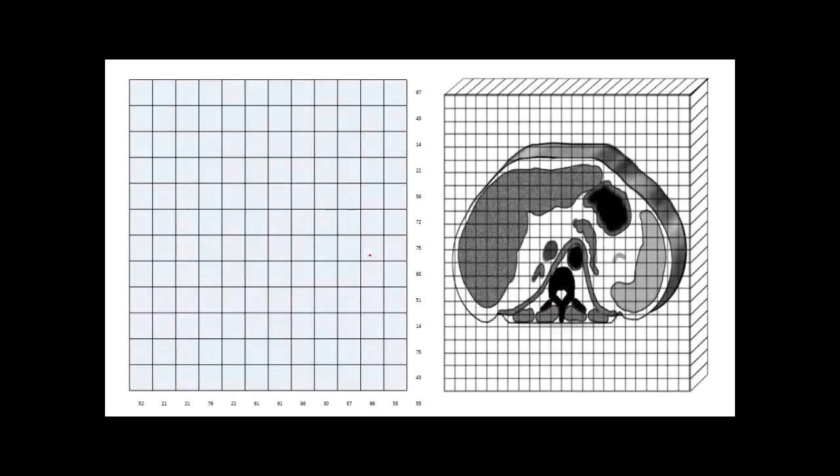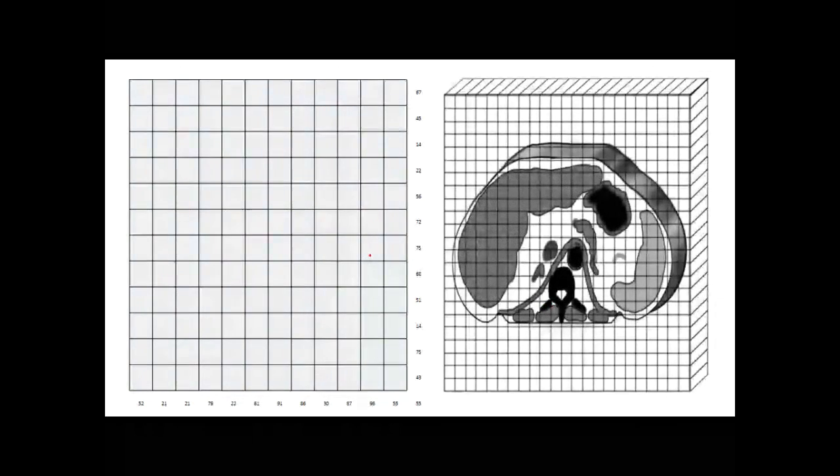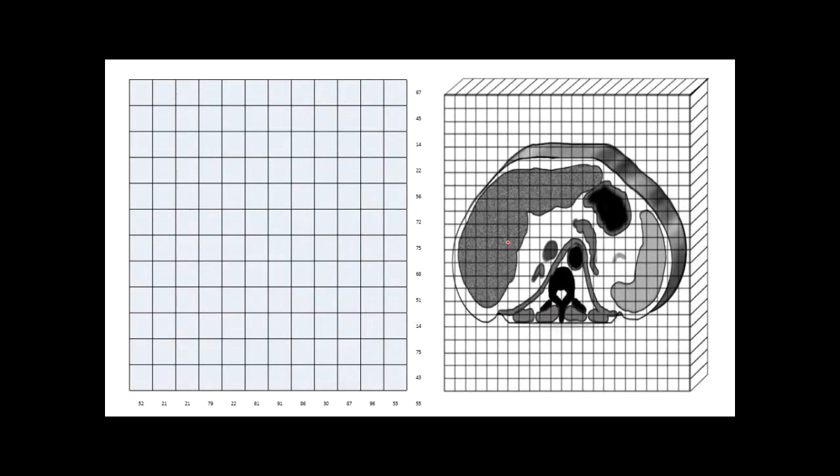Now, just multiply it by 1,000 pixels, for example, and you get the same image, following the very basic principles of back projection. There are other, more complex methods. This is the basic method.